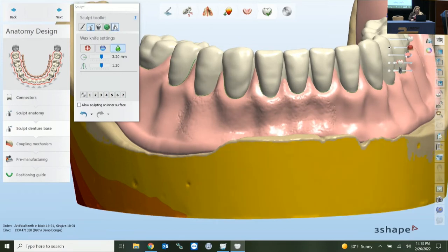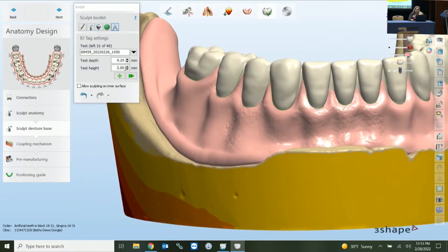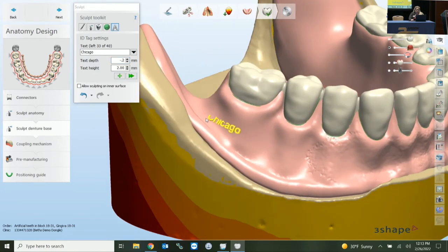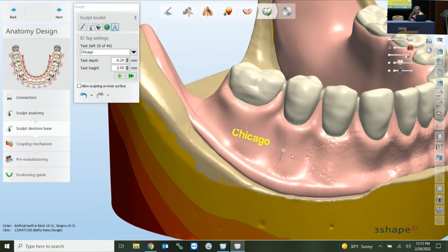They've also included an ID tag in 2021. You can come in here, type in whatever you'd like, and set the text depth as positive or negative, and the text height. Going plus, you can position it wherever you need it, and it will rotate as well.